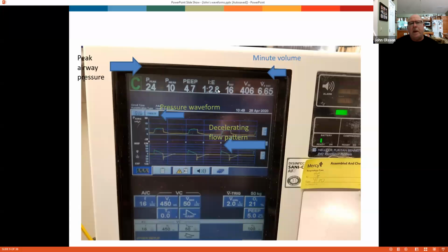And then the inspiratory to expiratory ratio. When you and I breathe, our inspiratory to expiratory ratio, or I/E ratio, is 1 to 2. Or 1 to 3. Some patients need a longer expiratory time if you have maybe an asthmatic or a patient with emphysema or COPD. They may need a longer time to exhale. So we can adjust that by adjusting the flow down here. If I push in that breath quicker, I get more expiratory time with that, okay?